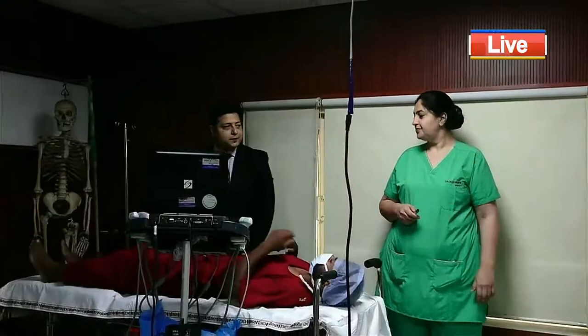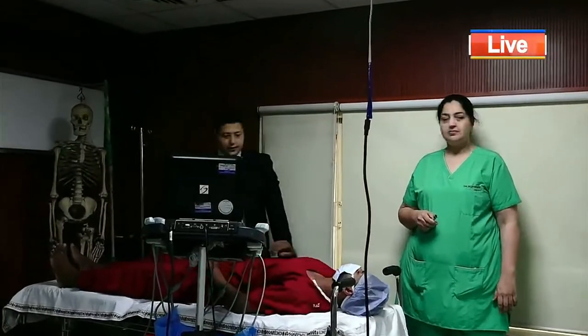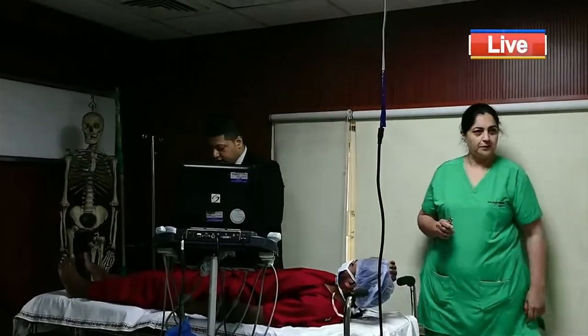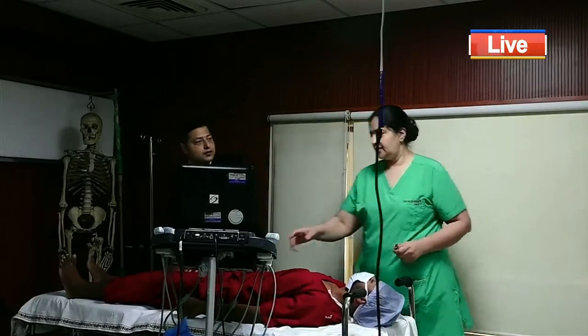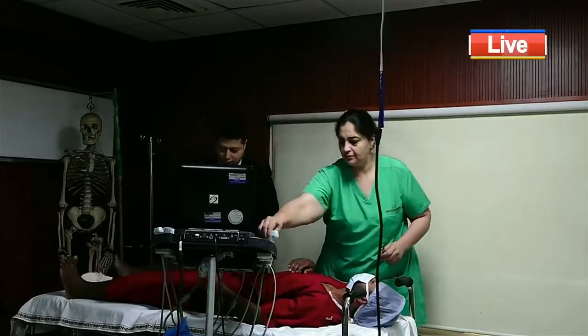Okay, now we go to the next part. So we're going to teach you the knee. Knee is very easy. Okay. And also very less risky. Unless, of course, you don't take sterile precautions and then get an infection for yourself and for your patient.